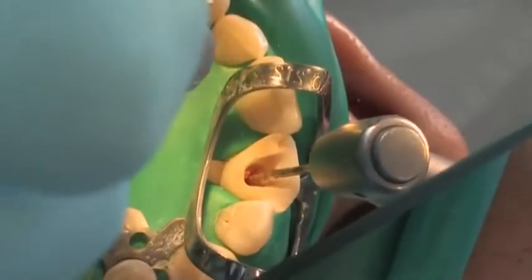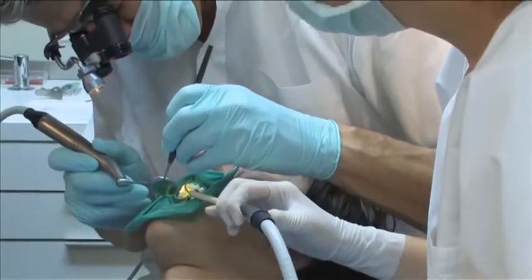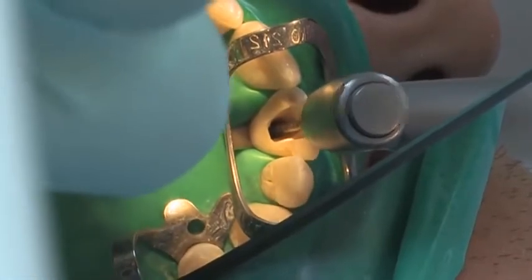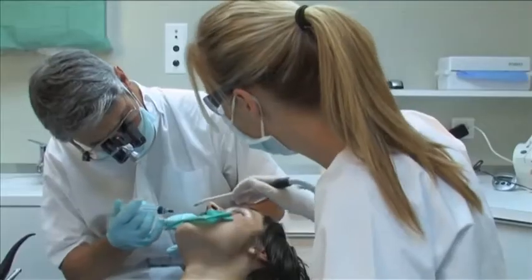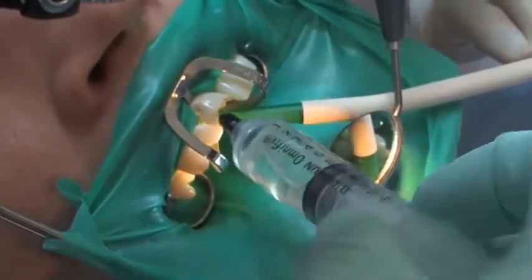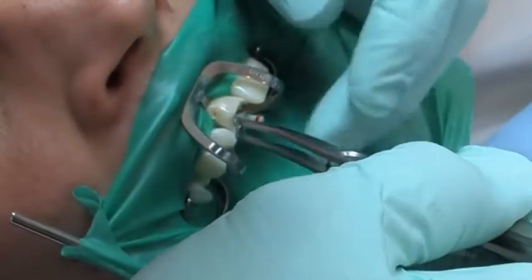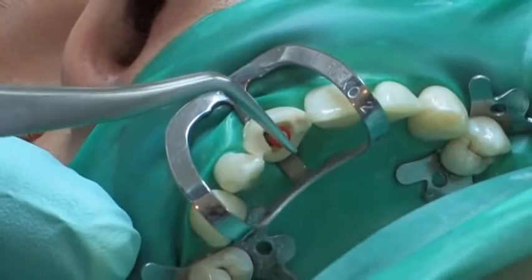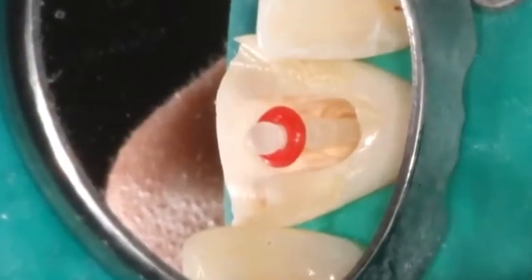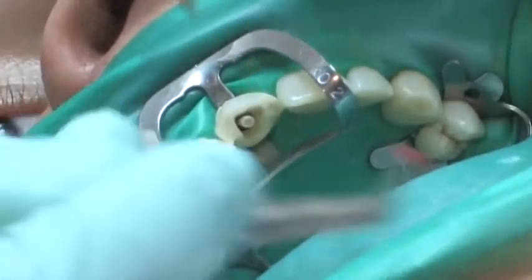The post space is then prepared using the color-coded Para Post drills in sequentially larger sizes until the predetermined post diameter and depth is achieved. The root canal is rinsed using sodium hypochlorite. The corresponding light-transmitting glass fiber reinforced Para Post Fiber Luxe post is trial seated and inspected for proper fit inside the root canal. The post length can be shortened as needed based on the clinical situation.